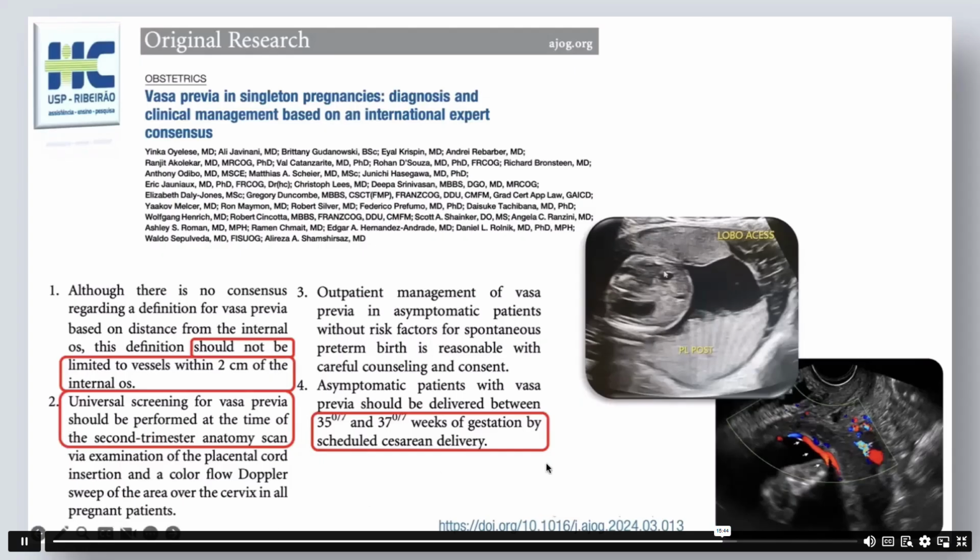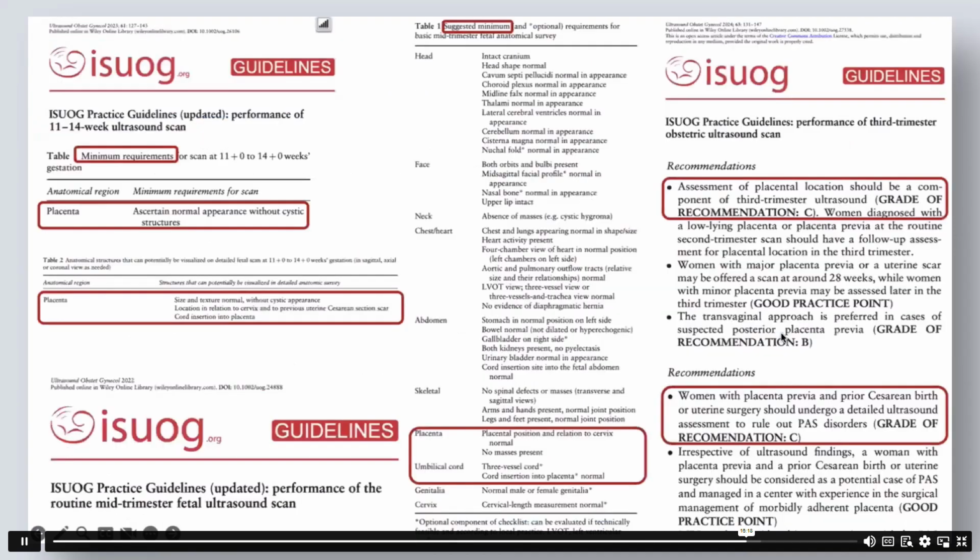And the importance of looking at these and knowing that the patient has vasa previa is to avoid the start of spontaneous contractions and the rupture of the membranes that might initiate fetal bleeding, and we usually recommend cesarean delivery between 35 and 37 weeks of pregnancy. It's usually more common for patients with reproductive assistance and for patients with low-lying placenta, placenta previa, and bilobate placentas, as you can see here. So we have to also mind the umbilical cord.